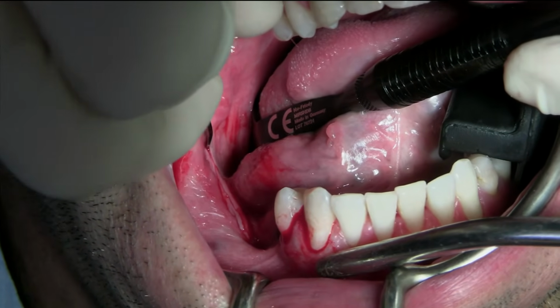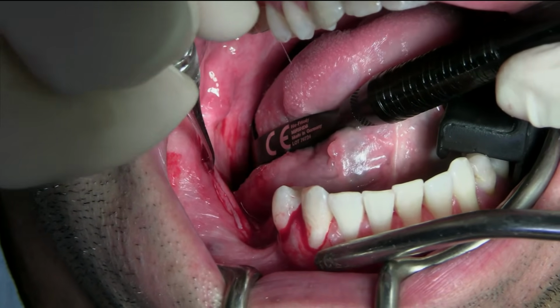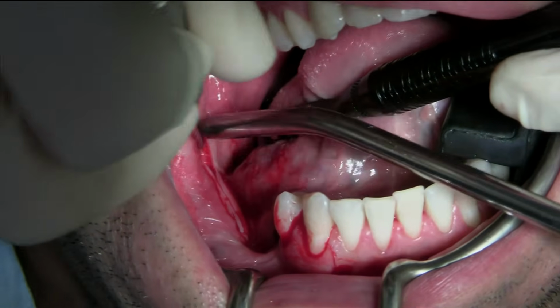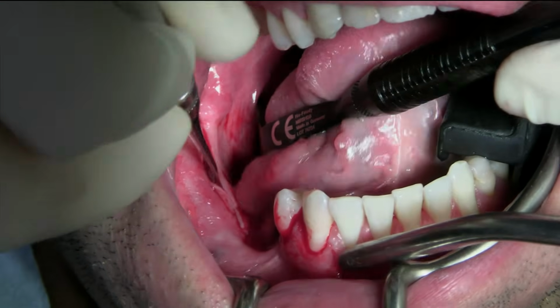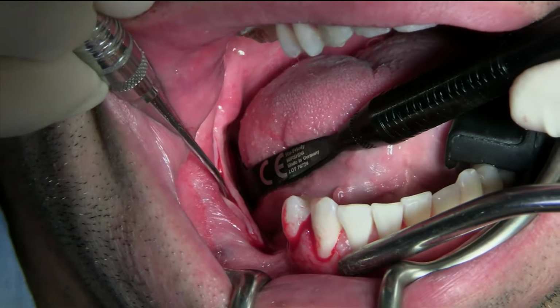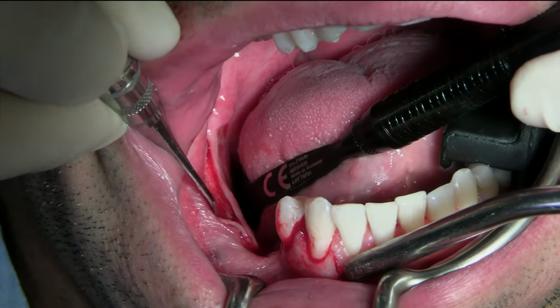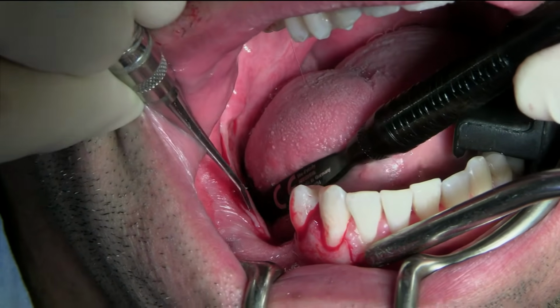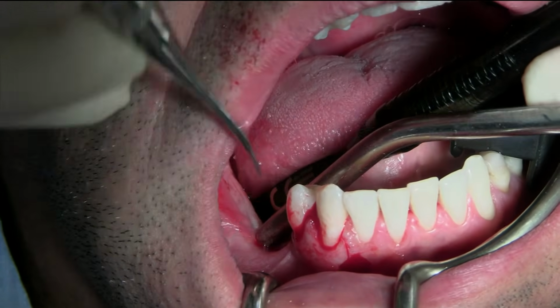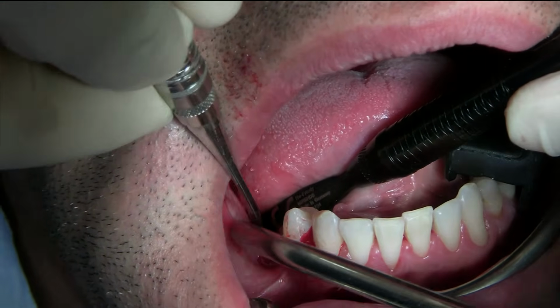I'm starting to make the first step into the elevation. My goal is to have a really clean, full thickness incision. A little bit of pressure there. This is going pretty nice because I have good keratinized tissue. Suction here. I cannot see here. Chin down, chin down. And I need some light here.